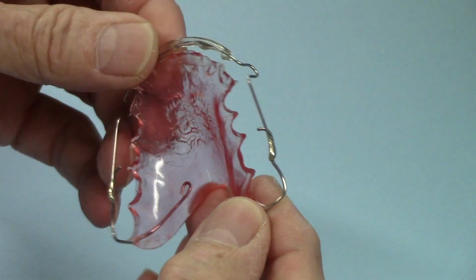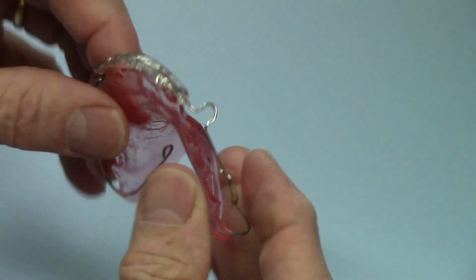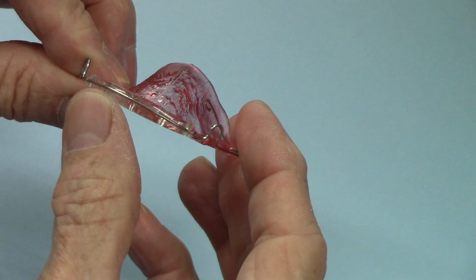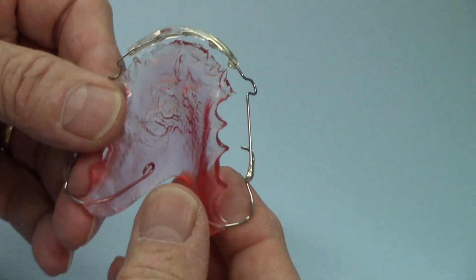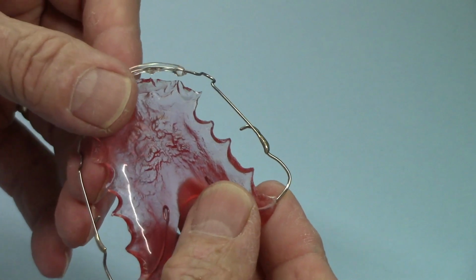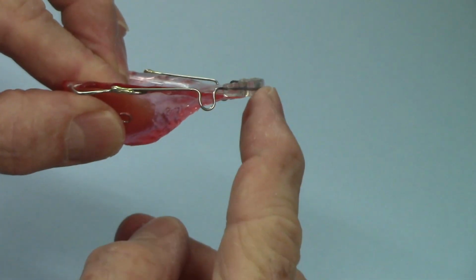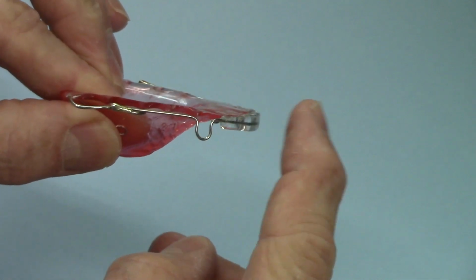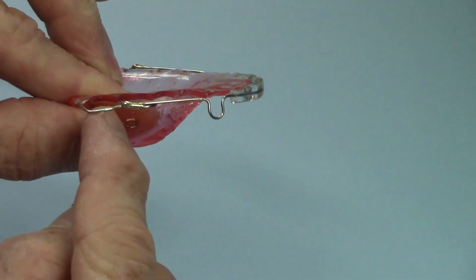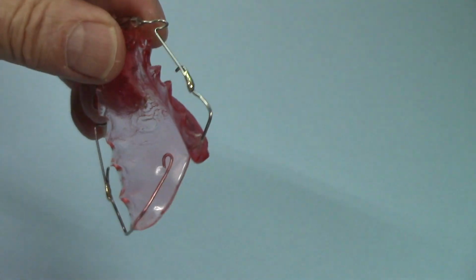Here it is finished. This particular one, the doctor wanted acrylic on the labial to cover the centrals and laterals. So that's going to give a good anterior retention, but that doesn't do anything for the posterior retention. Now notice the rigidity of it. It's pretty rigid because of that hard tempered 036 wire back there.